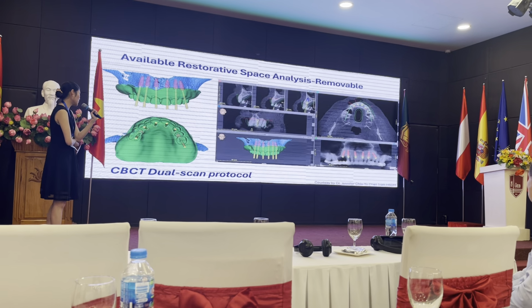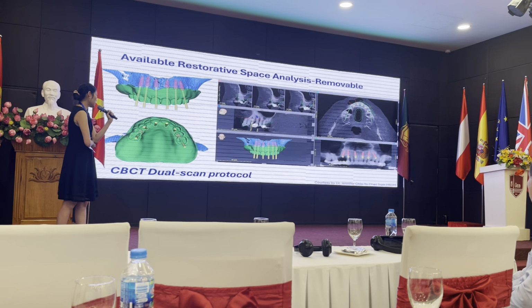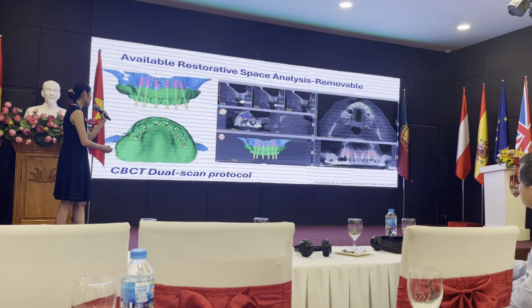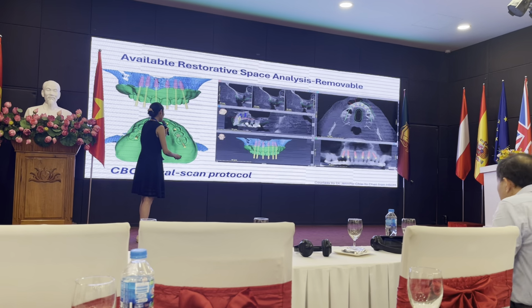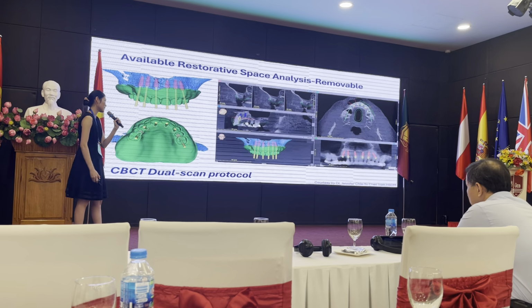So here I just wanted to show the dual scan protocol. And here, as you can appreciate, upper we are missing all the teeth. And here we deliver the dentures to patients first. And then we merge it with the CBCT. So here you can kind of see the flange and also the teeth position. And in that sense, it can help you to estimate where do you want to place the dental implant.